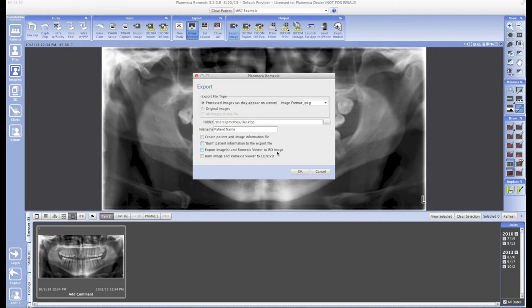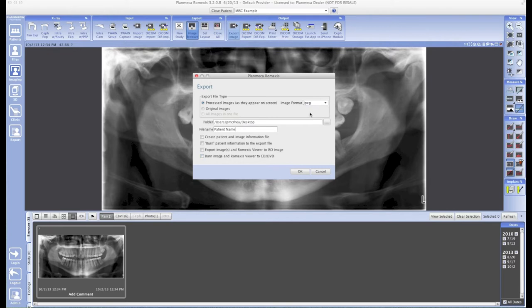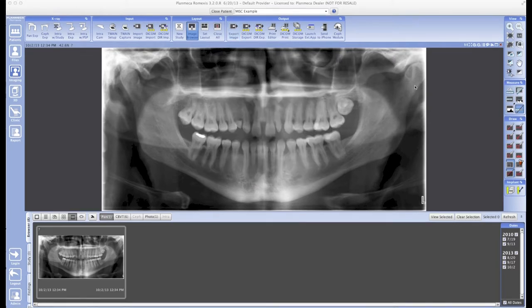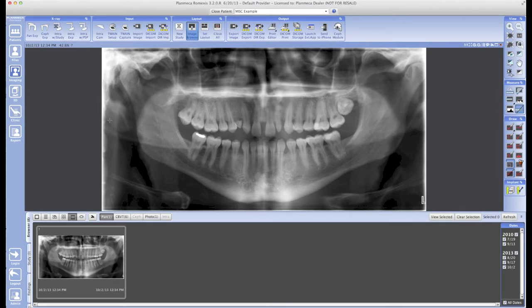The last step is the most interesting: Burn Images and Planmeca Romexis Viewer to CD or DVD. This is self-explanatory. If you check that box and hit OK, the Romexis viewer is going to immediately start looking for a blank disk in your disk drive, and it will subsequently burn that image to the disk along with the Romexis viewer. Now moving on—3D images can also be exported in Romexis. I'm going to show you how to do that now.